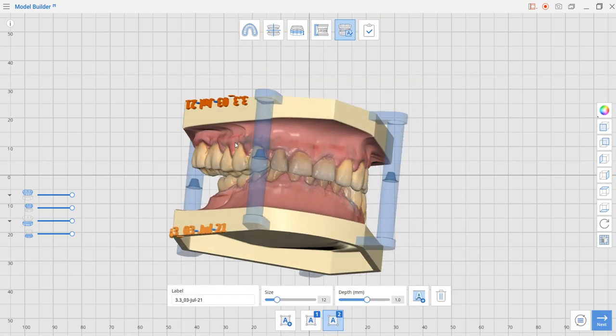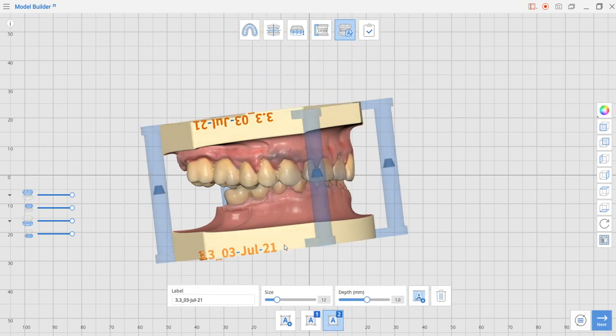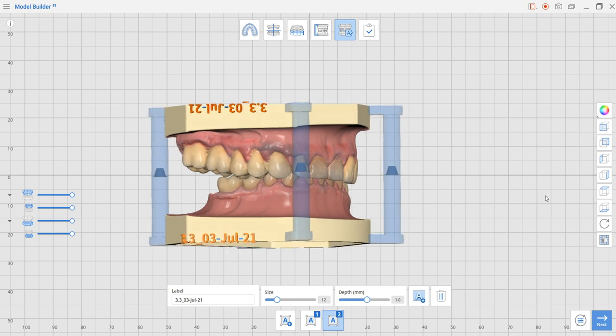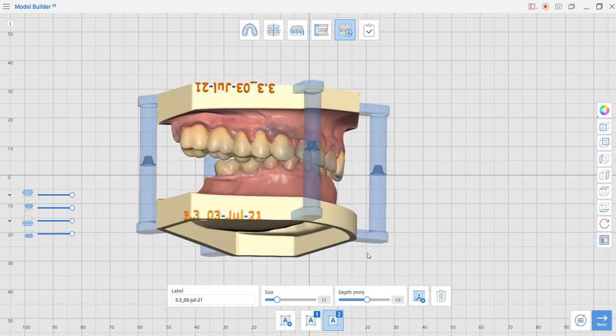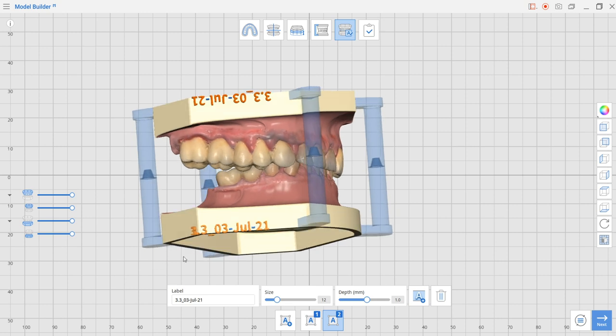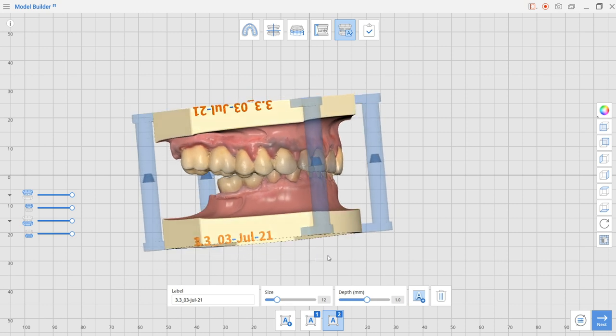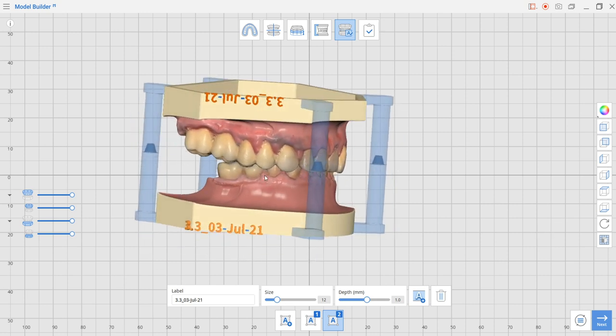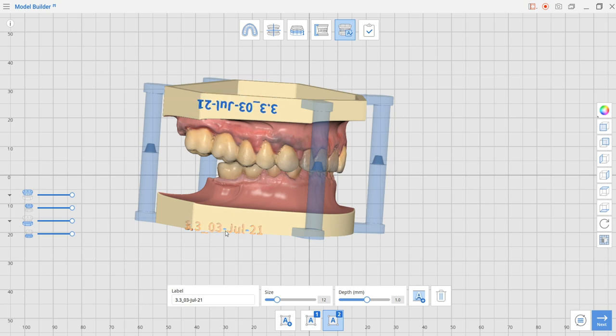This is the label step. You can see the labels are auto-generated with the name of the case and the date. They can come in orange, which means they are not going to be able to be attached to the bases, so we are going to find them a new location and now that we did, see that they change color.